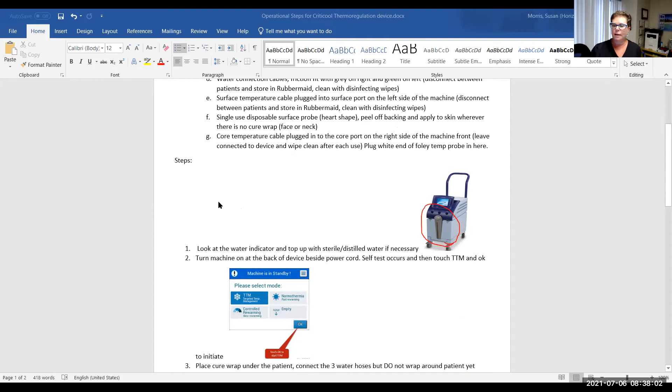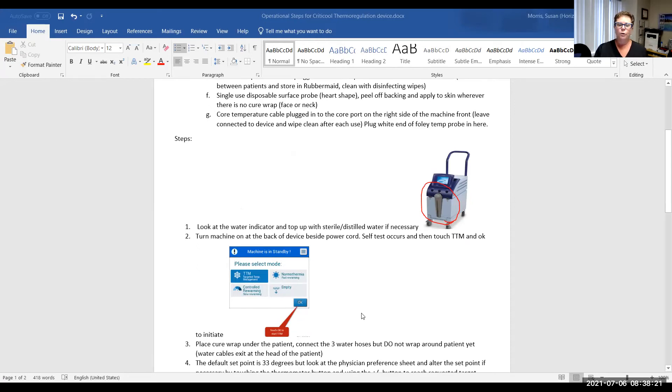And so our steps, we're going to take a look at the front, make sure that there is adequate distilled or sterile water in it. We're going to turn the machine on at the back. It will come on with this display. It defaults to targeted temperature management. So you're going to click OK. You're going to lay the patient up on his side and get the cure wrap underneath him with those three water cables coming out at the head. And you're not going to wrap it around him yet. You're going to connect them and ensure that it fills with water.